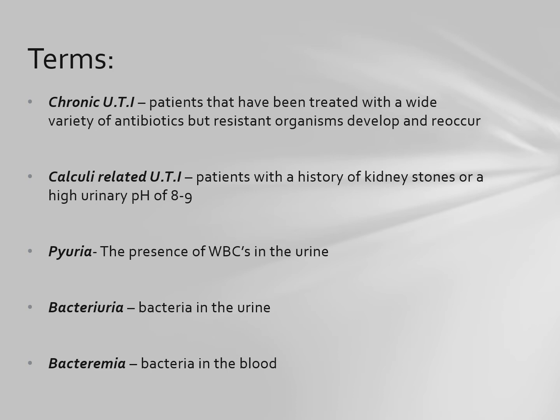Now, it's really interesting. If you have a urinary tract infection, you can correlate what's going on with the urinary tract infection to the chemical dipstick when you've done a urinalysis test. For example, if you have a urinary tract infection, the urinalysis exam will show positive white cells or positive leukocyte esterase, positive nitrite. Blood could be positive or negative, and then the microscopic findings would be white cells in the urine, bacteria in the urine, and even red cells in the urine. So it's interesting that you can correlate what's going on with the urinary tract infections to what happens on the urinalysis chemical exam.